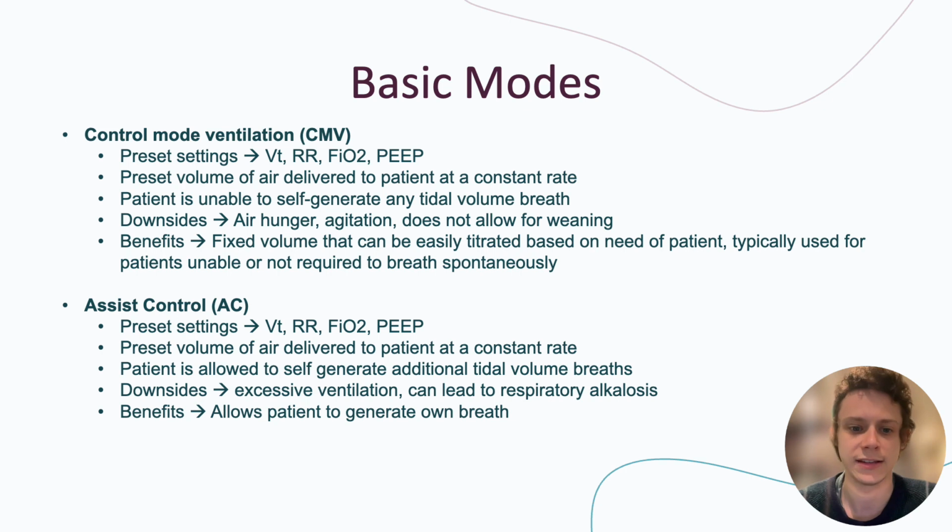Some of the downsides: if the patient has a lack of sedation, is under-sedated, or is going through a sedation interruption, it can lead to air hunger and agitation, because as you can imagine, if you are awake and not able to control your own breathing, it's going to be very uncomfortable. And it's also not going to allow for weaning, because the patient is not doing any respiration on their own.